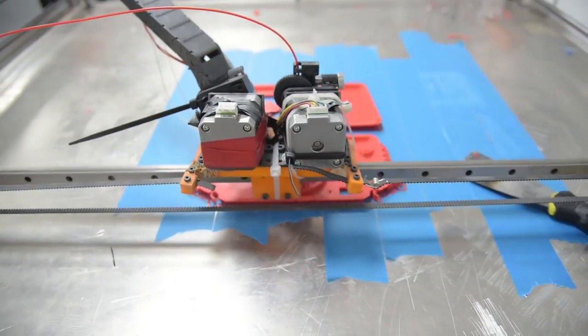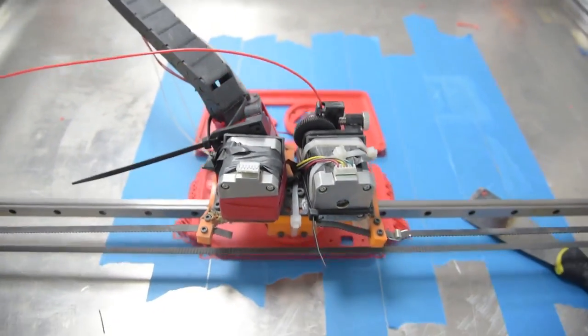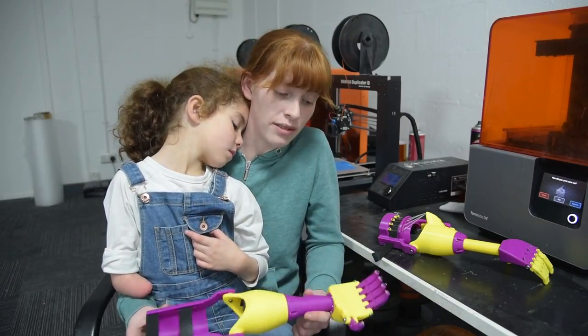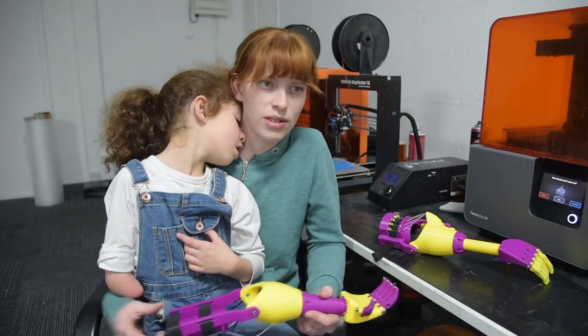I just love the fact that it's colorful and it's very lightweight — that's a massive thing for us, because other prosthetics she had in the past have just been quite heavy, whereas this is quite lightweight. I think she'd be more excited to wear this than anything. She's taken it to school a couple of times and she's had a lot of attention, which I think is really good.